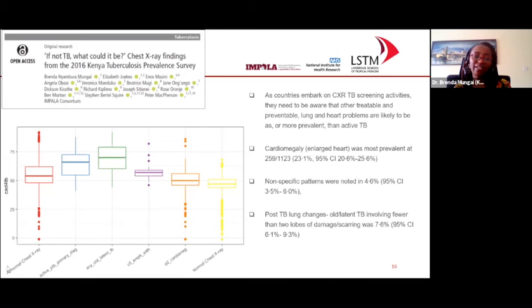So as you can see here, these are box plots to show that for those that had some abnormality, this is abnormal chest X-ray for any reason, the scores were high. Active TB, clearly higher scores. So these were by radiologist reading. Then we compare what were the CAD scores. So all this down here were by expert radiologists. So those that they found that had active PTB then had higher scores, as you can see here. And also those that have old or latent TB.